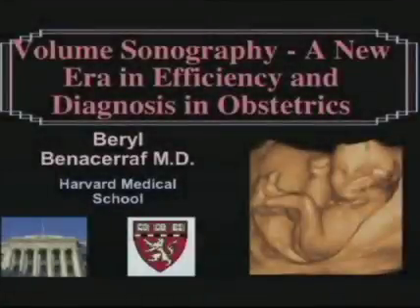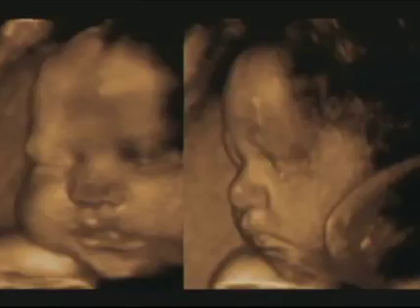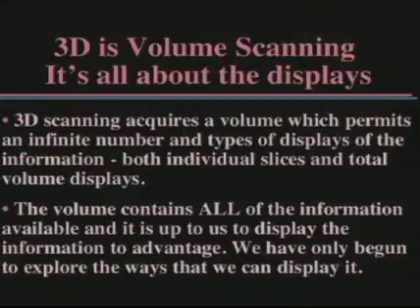Volume sonography, otherwise known as 3D ultrasound, is a new era in efficiency and diagnosis in fetal imaging, which I personally am very, very excited about. And I think for a while 3D ultrasound gave the wrong impression out there, because people thought that it was all about just getting pretty pictures of the face like these. And in fact, it's a lot more than getting pretty pictures.